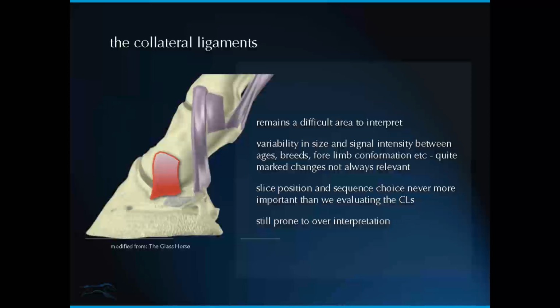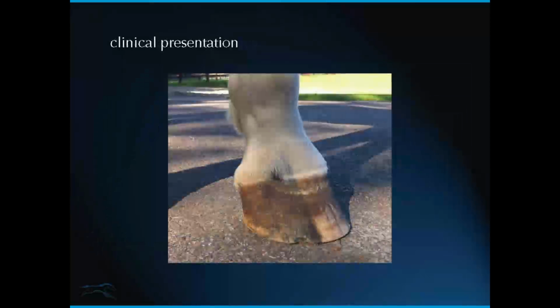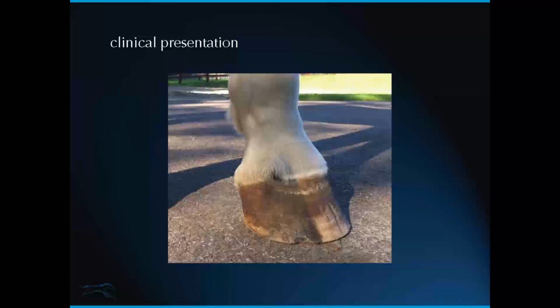And yes, they are still prone to over-interpretation, so if you're struggling for diagnosis, many people just put that as a finding, and I think we're probably pinning that disease on a few too many horses. But when you see the obvious ones, they're quite dramatic, so it's important to remember where they're positioned. They're sort of more dorsal than most imagine, and this is a horse with a ruptured proximal collateral ligament, and you can see the bump hopefully over the coronary band here.